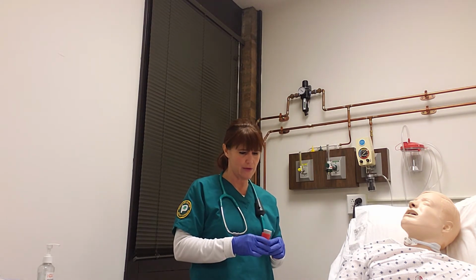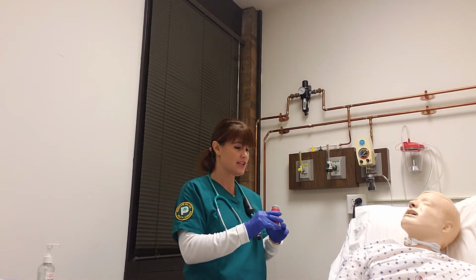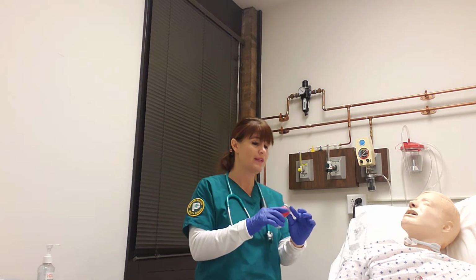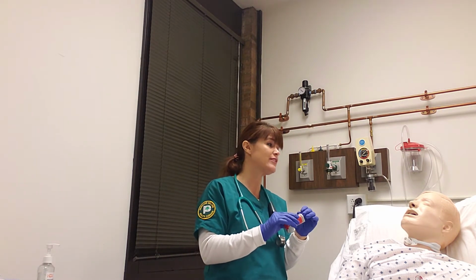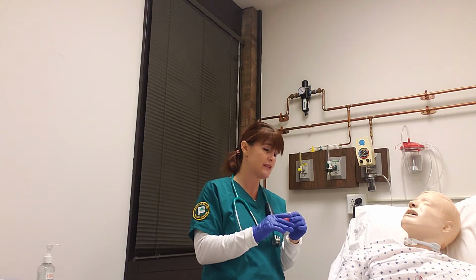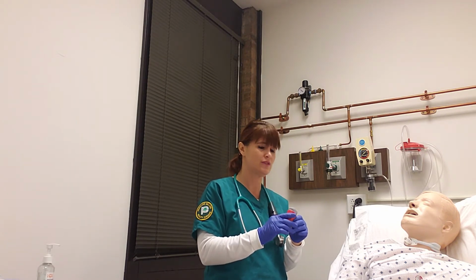Another important thing I really want to tell you is that this medication has a counter on top here. When it hits yellow, that's at 20. This is when I want you to call the doctor and make sure you have another prescription waiting for you at the pharmacy. Don't wait until you're out. You don't want to do that.